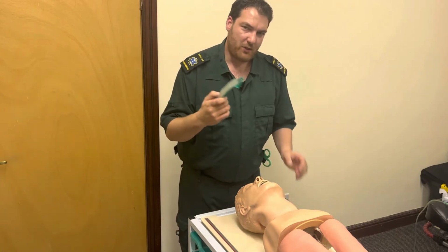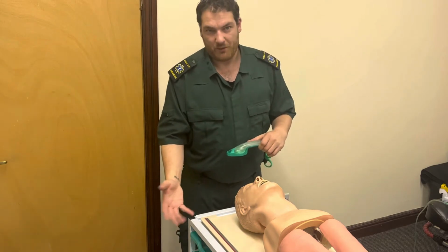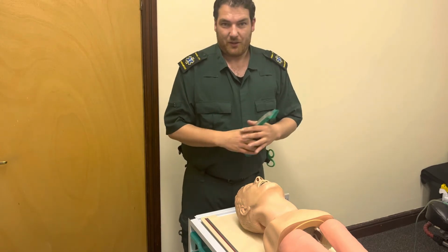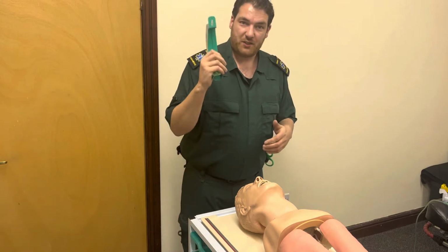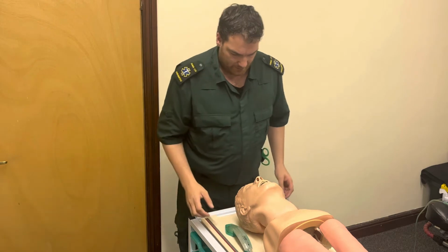Now when you attempt to put an i-gel in, you try twice. If it doesn't work, go back to what worked before. We've got the airway ladder. It goes from maneuvers, it goes from the adjuncts, and then you've got the supraglottic airway devices, which are the i-gels, and so on and so forth. Okay? Right, so let's try this.